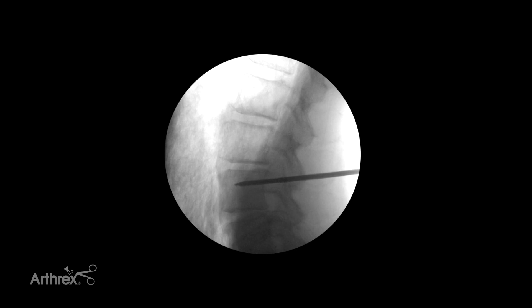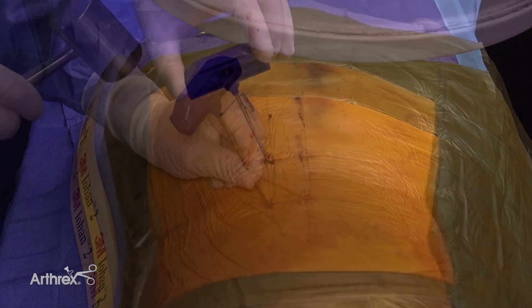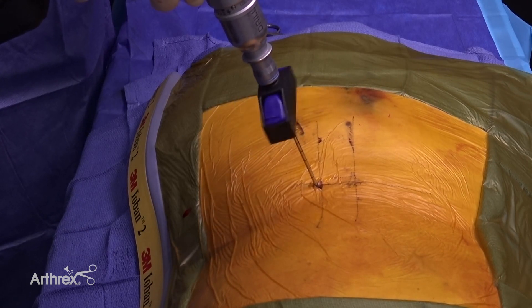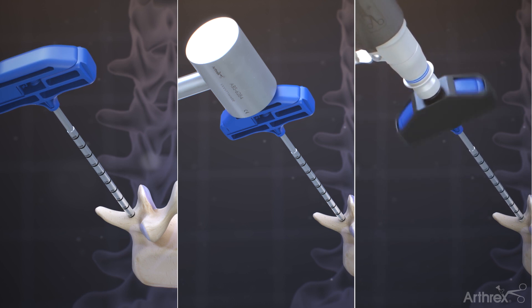Insertion of the needle into the pedicle can be done one of three ways: using a mallet to gently tap the top of the needle handle, by manually twisting the needle into the bone, or by using the needle's power adapter connected to a battery powered drill. It is also acceptable to use any of these three methods in combination with each other. This technique for needle insertion can also be used in an open procedure as well.